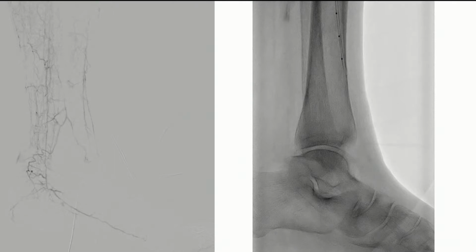This is a woman who was having severe pain. She couldn't sleep through the night, which is another one of the hallmarks of critical limb ischemia. And she came for a second opinion. And what we did after this initial procedure, as we see on the right, if that plays, you can start to see our catheter and wire working down the front of the leg. And while it's going to take a lot longer than what we can show you, we're working our way through a completely blocked artery and working our way down into the foot.